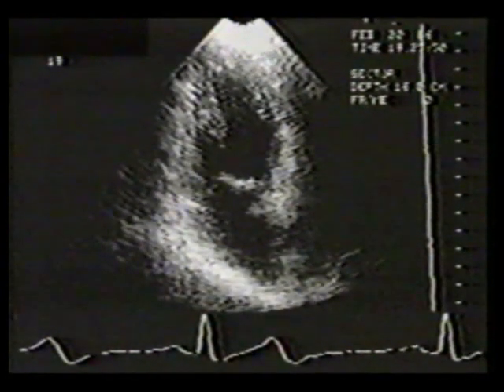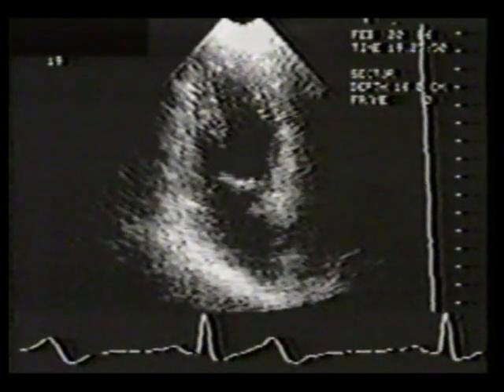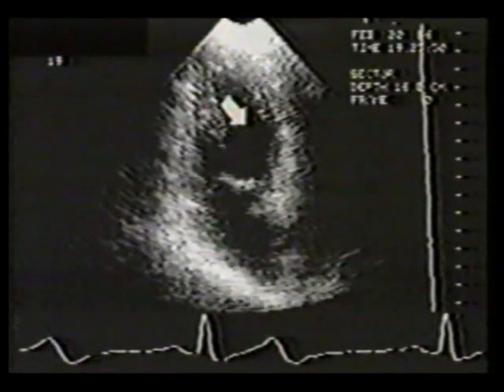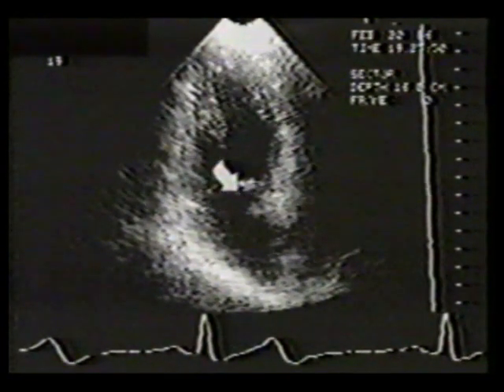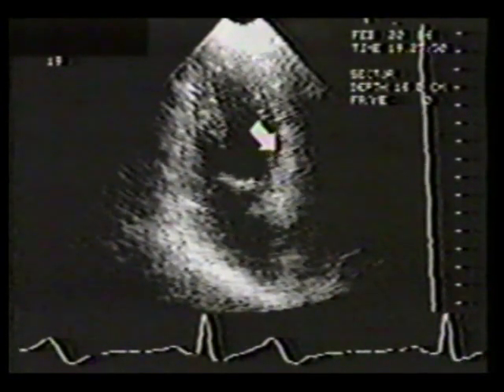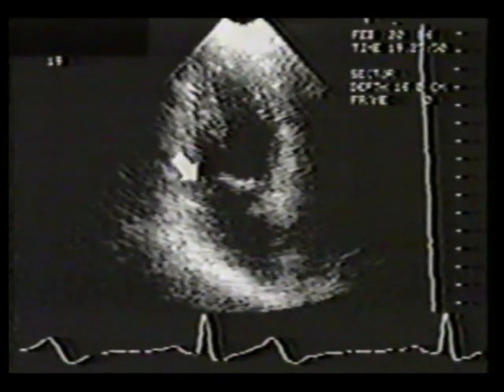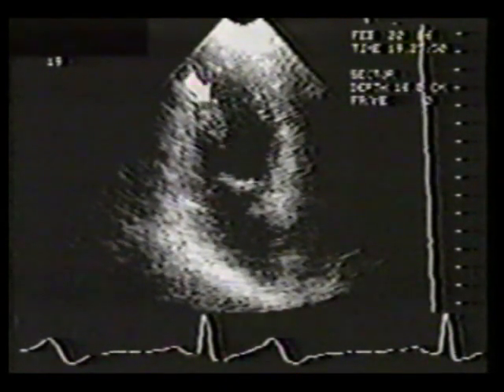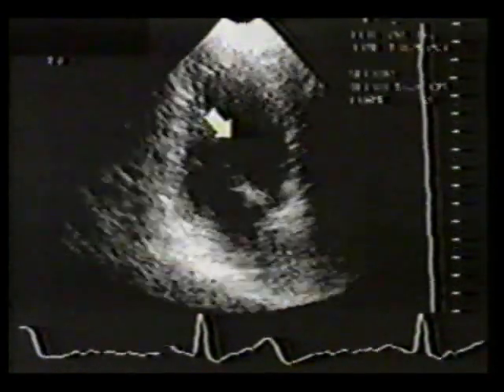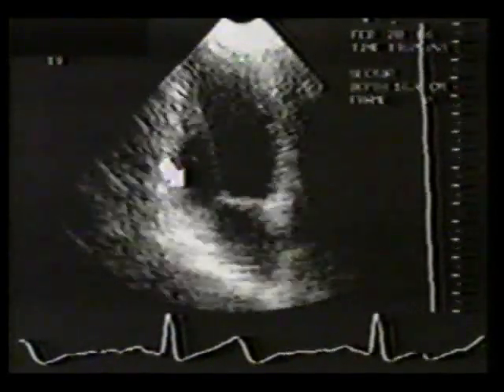The transducer has now been rotated even more clockwise, and the tip has been tilted slightly laterally. This is the apical two-chamber view. The left ventricle and left atrium are separated by the anterior and posterior mitral leaflets. This is the anterior free wall of the left ventricle, and this is the full length of the inferior wall. This is the posteromedial papillary muscle. In this normal subject, all segments of the anterior and inferior walls are thickening normally.